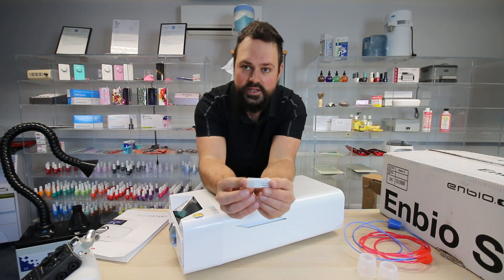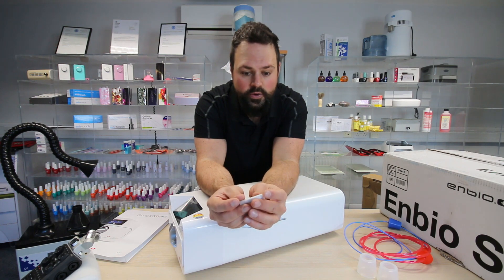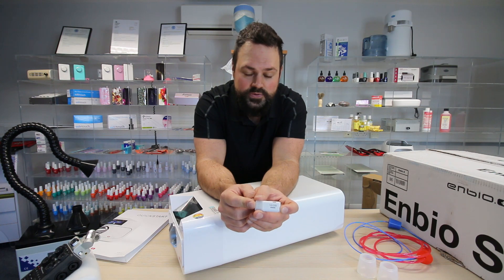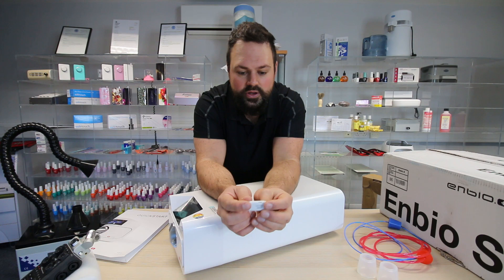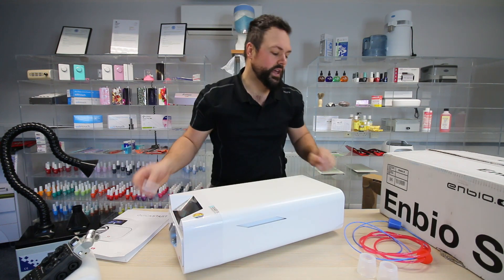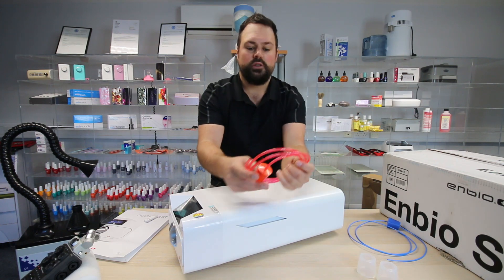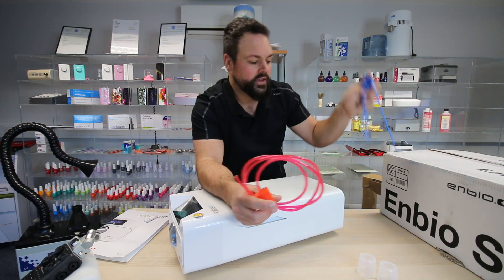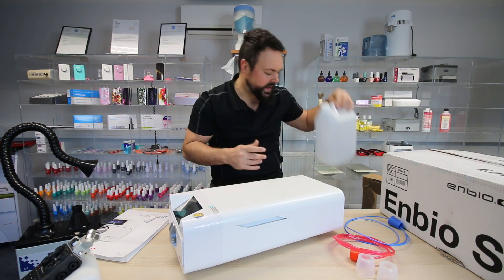You get the all-important USB stick — this is the brains of the operation. There's software on here, there's user manuals, there's a lovely installation video. Very useful. Rather than having to read through a massive thick binder book, everything is on this USB stick. You get two tubes — a red tube and a blue tube. The red tube puts your water out, and the blue tube takes your water in. You'll want a canister like this.